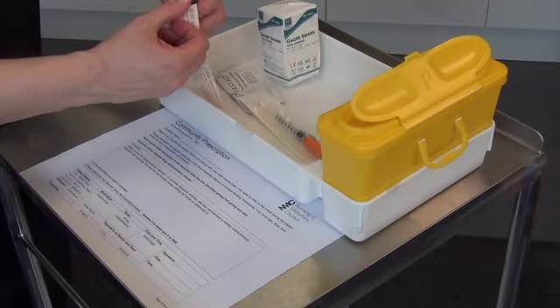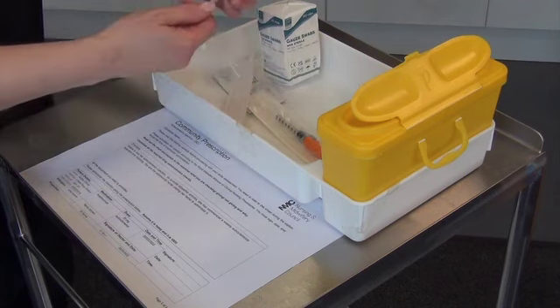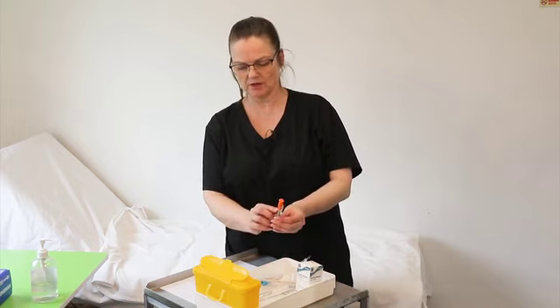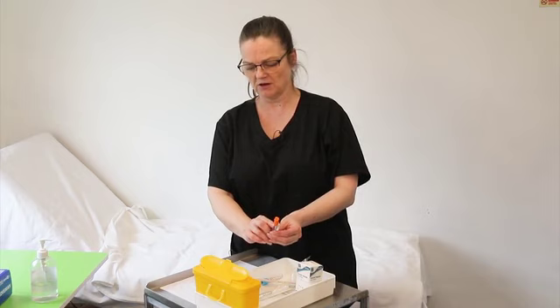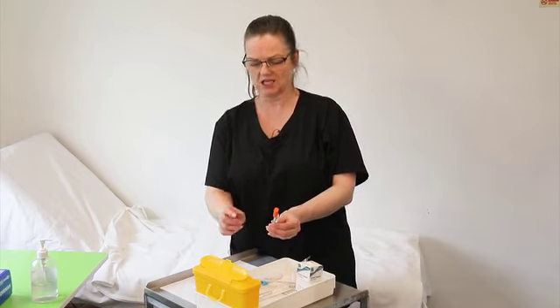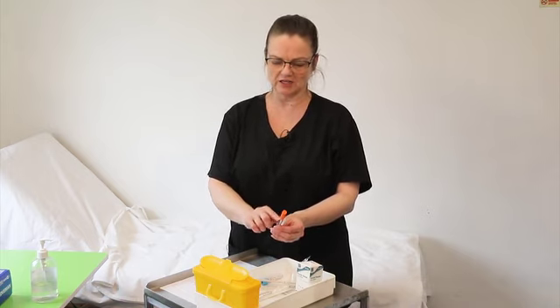Therefore, they have increments on both sides of the syringe itself. So you've got 15, but then on that mark, the dark mark, underneath it's got a little mark on the right hand side of it for 16, then on the left hand side of it for 17, and so on, and it goes like that.